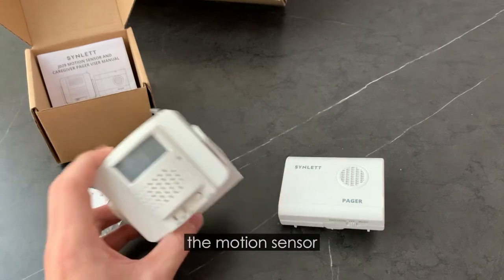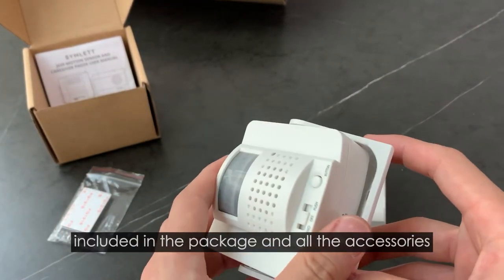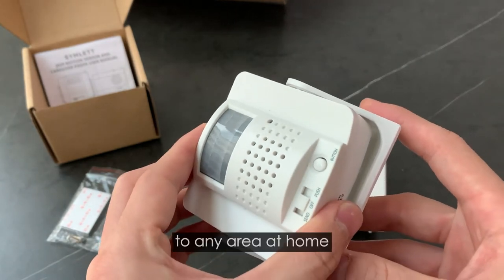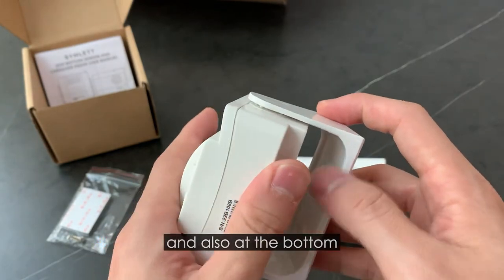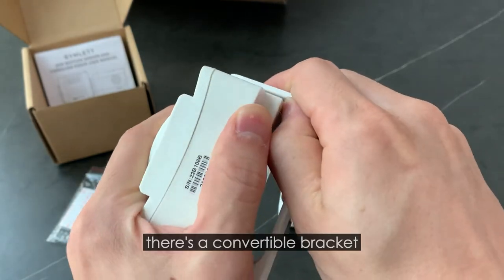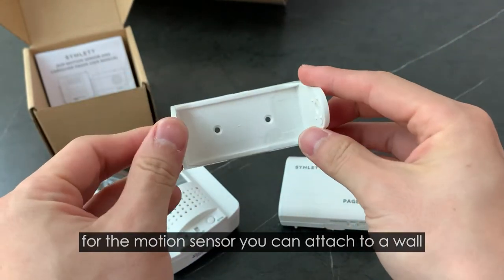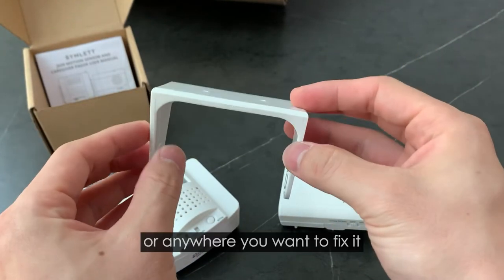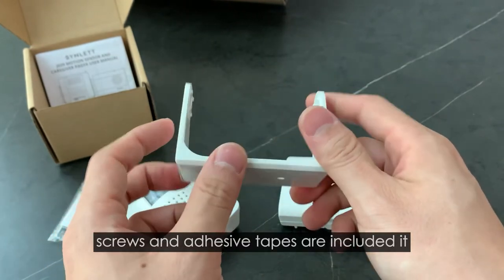The motion sensor has three AA batteries, all included in the package, along with all the accessories for you to attach it to any area at home. At the bottom there's a convertible bracket for the motion sensor — you can attach it to a wall or anywhere you want to fix it. The screws and adhesive tapes are all included.